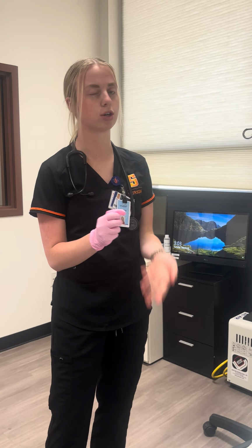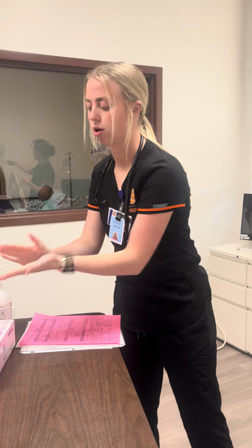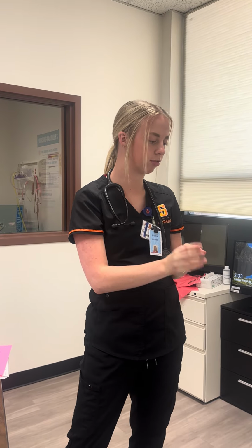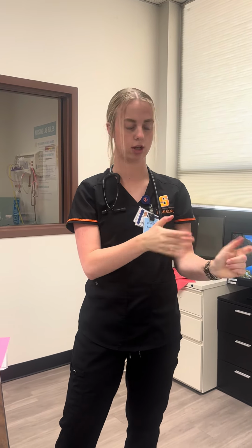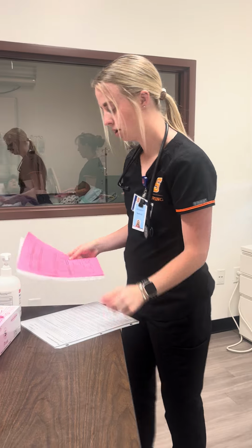We just want to make sure this is hooked up, as the blood needs to be hooked up and running within 30 minutes of taking it from the blood bank. So that's always something that we want to hurry along with. So I'm going to leave the room for a minute, make sure my patient's still feeling all right. All we've done is normal saline, so they should be okay. And we are going to go to the blood bank.